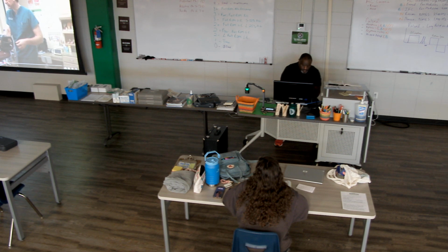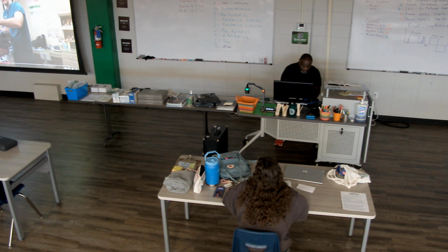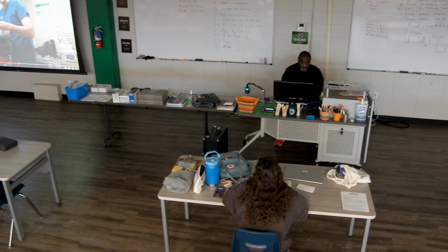It goes on for about 45 to 55 minutes, and it's a small electrical current that goes from one side to the other, and that heals bone. It's what we call a bone stimulator. If a person has a non-union or malunion, something very frustrating and painful, over an extended period of time this could help relieve some of their pain and heal the bone.